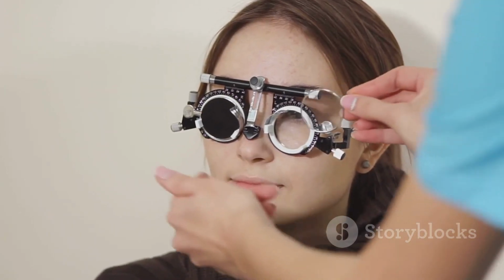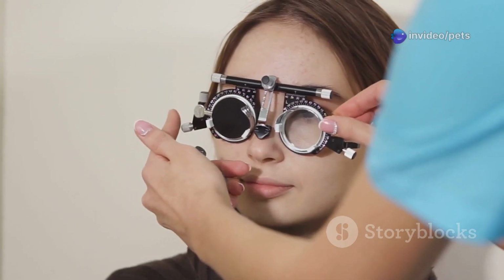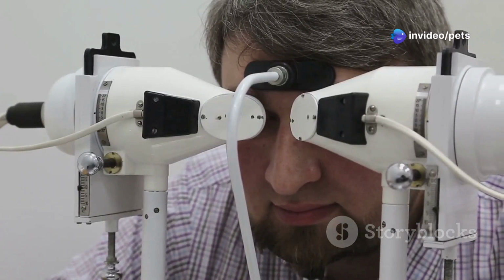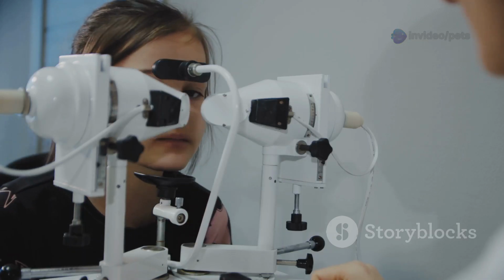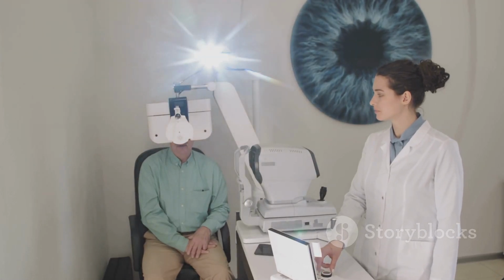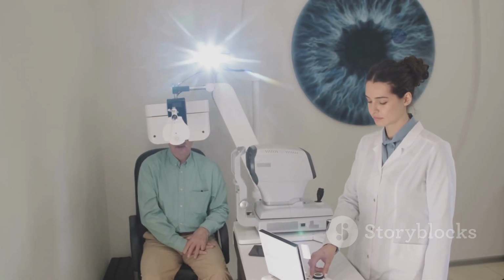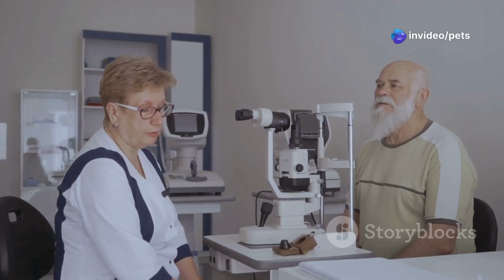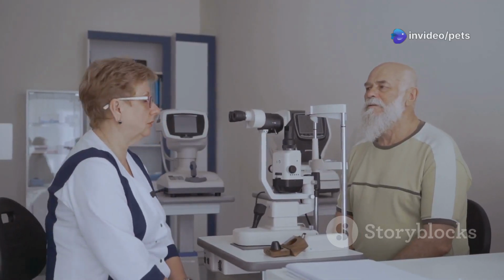During subjective refraction, the optometrist presents the patient with different lenses and asks them to report which lens provides the clearest vision. This process helps to refine the prescription and ensure that it aligns with the patient's subjective visual experience. The optometrist also considers the patient's lifestyle, visual demands, and any underlying eye conditions when determining the final prescription.